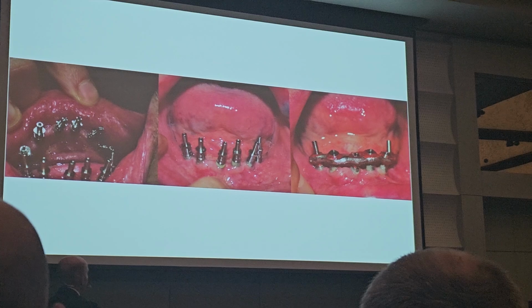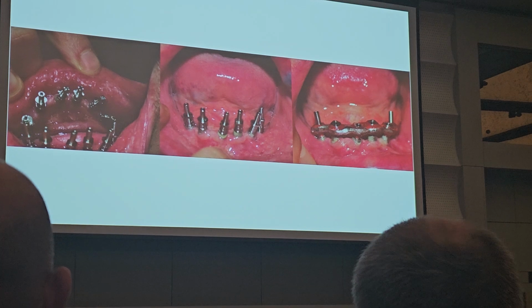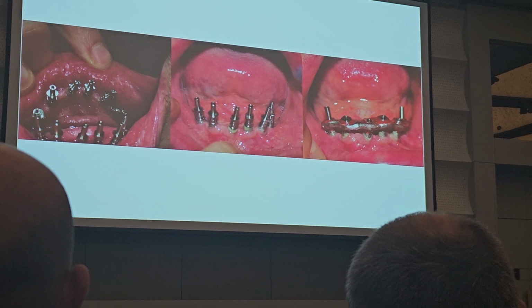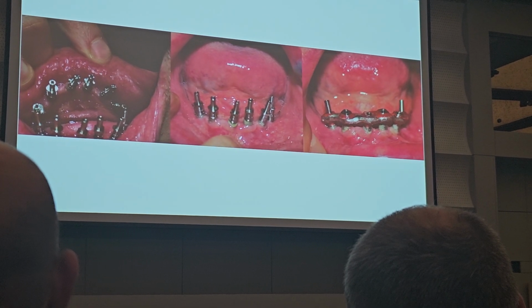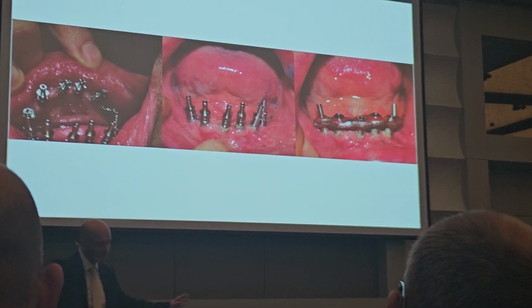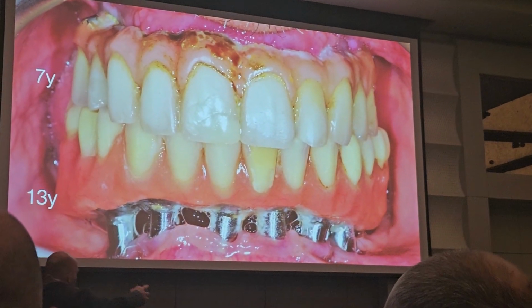This is my first case. You can also see the finger. This is the gold framework. We did it 3 times because it never fit passively, since we were casting at the time. In the end we decided to cut and solder, but there was always a problem with passivity. At the end we screwed it, that's it. It's not a problem. And this is after 13 years.